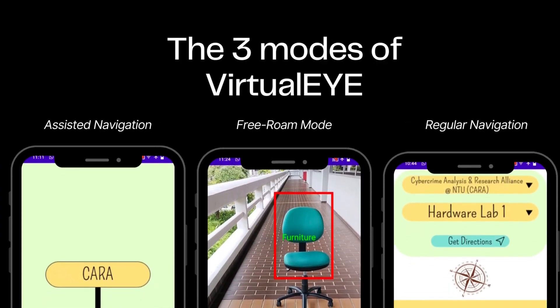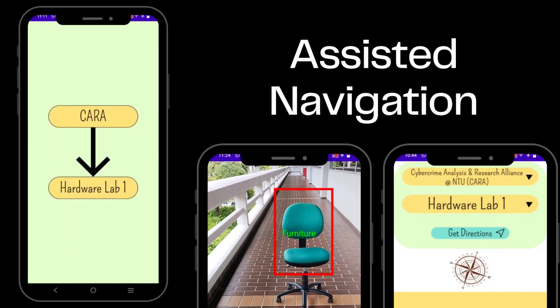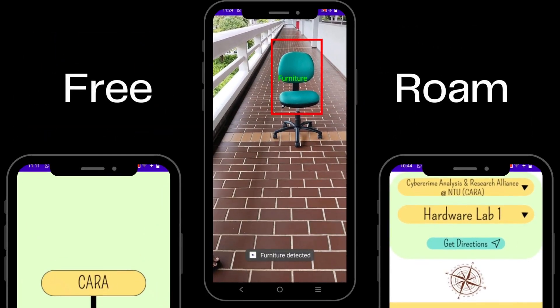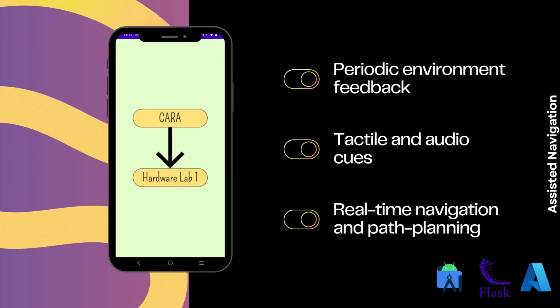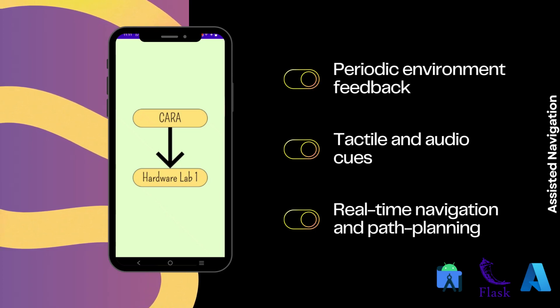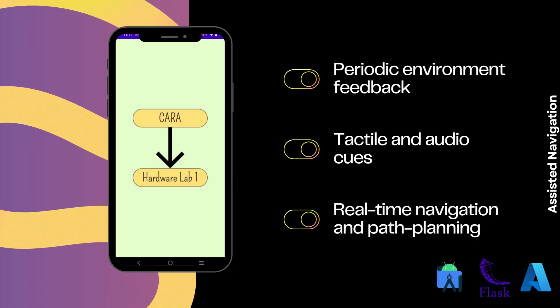There are three available modes currently offered by VirtualEye. First is Assisted Navigation, which guides the visually impaired user from their current position to their desired destination. Next, we have Free Roam mode, which warns a visually impaired user of the obstacles in their path. And lastly, we have Regular Navigation, a vision-based navigation mode consisting of an interactable map with text-based directions, visually guiding the user in indoor settings. The Assisted Navigation mode enables visionless navigation by utilizing sensor and Bluetooth beacon data to provide constant feedback to the user in the form of phone vibrations and periodic audio cues.